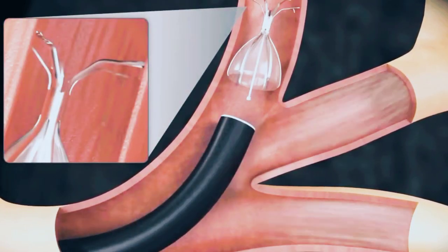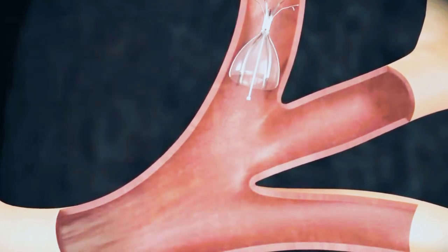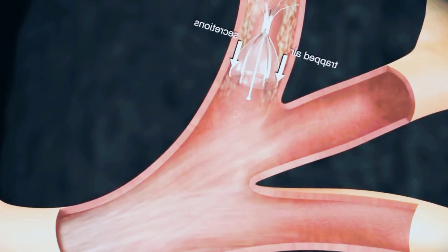There are five anchors that gently penetrate the surface layer of the airway preventing migration. Once in place, the IBV valve expands and contracts with breathing, blocking distal air flow while allowing trapped air and fluids to escape.